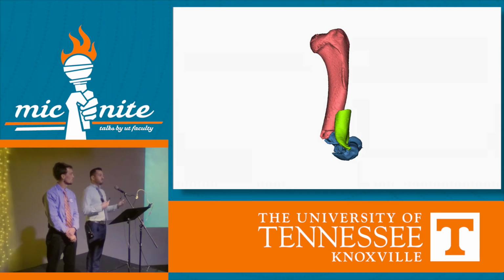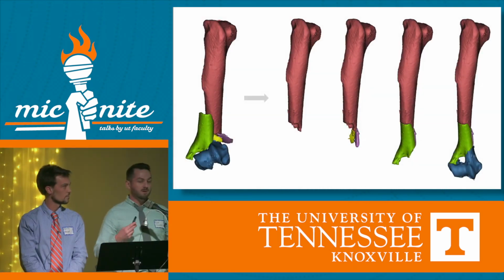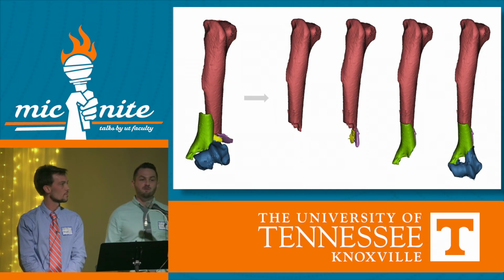And then, once I can move them around, just like somebody might animate a Monsters, Inc. movie, I'm going to put each piece where they used to be until I'm left with, on the far side here, completed fractures. So this is what I need in surgery, and now I know where that purple piece, pink piece, and yellow piece go. So this makes it very easy for me to think through things when I get in the operating room. But we can take it another step further.